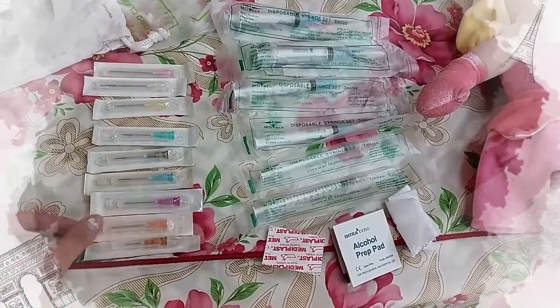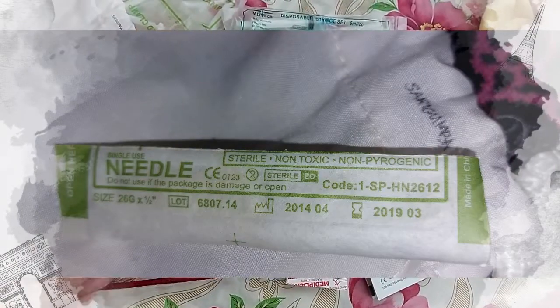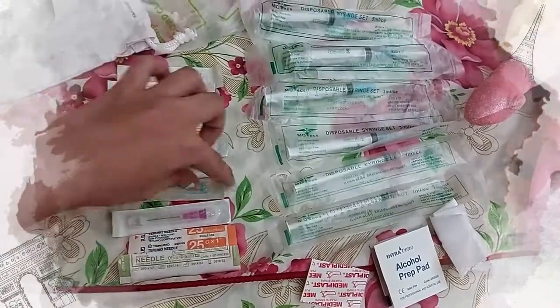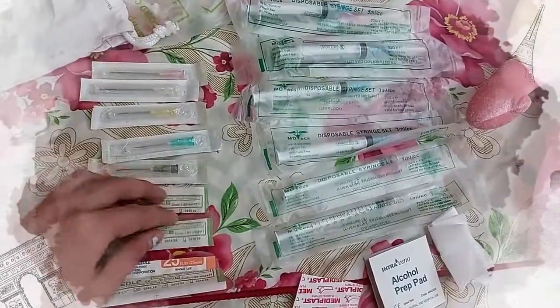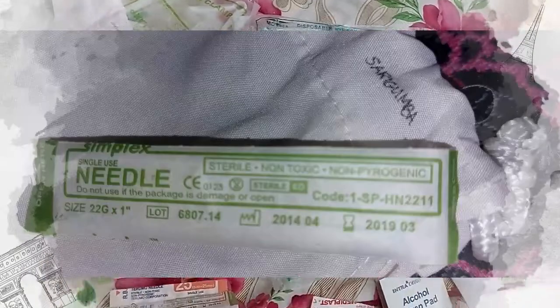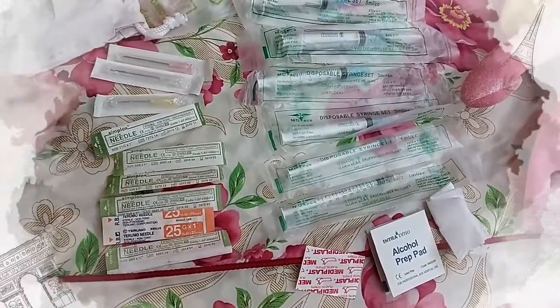For intradermal, I can use needle sizes 25 to 27. I don't have a number 27, but this is a number 25 and 26. I'll be using the number 26 for my intradermal injection. For the deltoid intramuscular, I can use number 23 to 25. This is number 23, and this purple one is number 25. For the ventral gluteal, I can use needle number 21 or 22. For subcutaneous, I can use number 25 and number 30 for insulin injections.